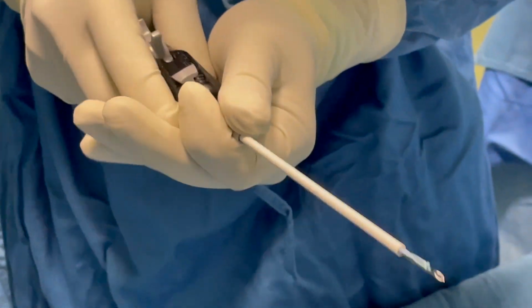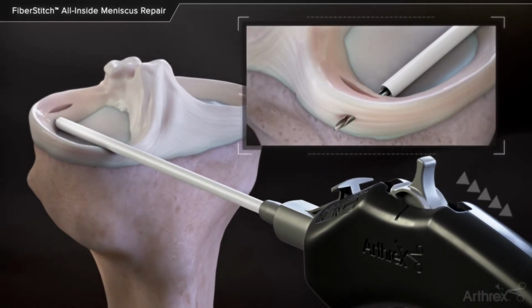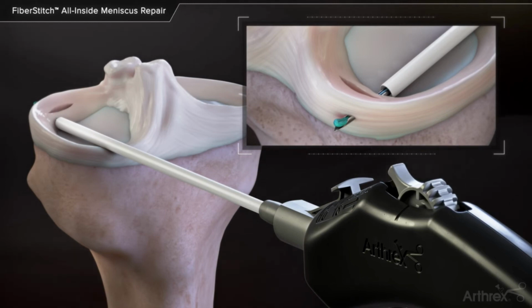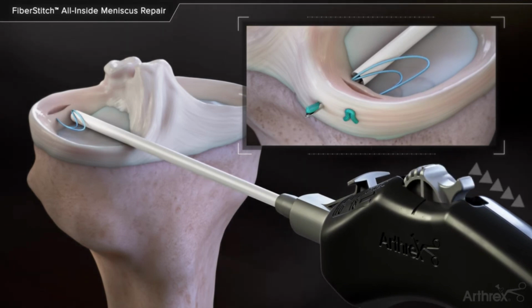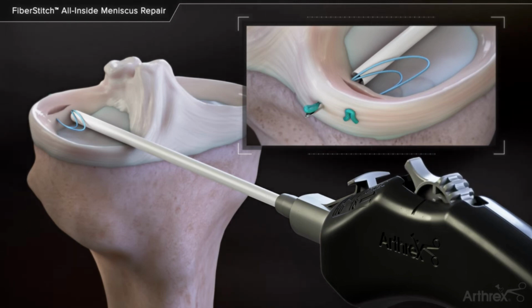Assessment and tear identification. The surgeon carefully examines the meniscus using the arthroscope to assess the size, location, and type of tear. Not all meniscal tears are suitable for repair, and the surgeon will determine if repair is possible based on these factors. Preparation. Once the tear is identified, the surgeon prepares the torn edges of the meniscus by removing any damaged tissue and creating a clean, stable edge for the repair.